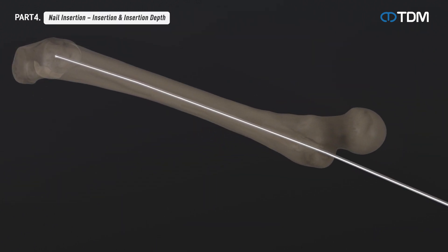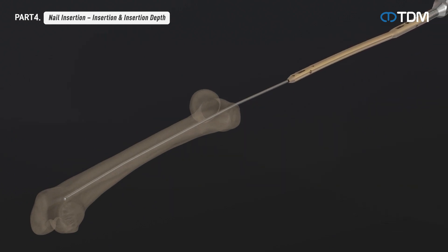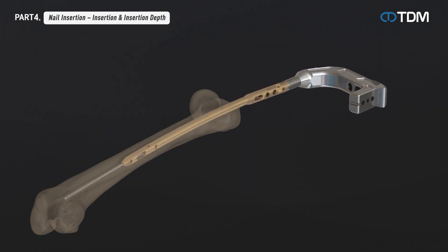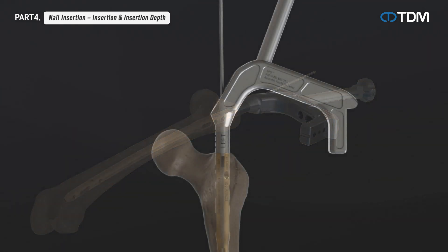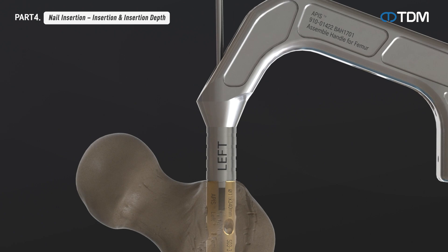When the nail and assembly handle are combined, insert the nail along the reaming rod. To prevent additional damage, the nail is inserted by turning it in the lateral direction while inserting it anteriorly, based on the assembly handle and according to the curve of the bone. Attach the impact handle to the assembly handle as necessary and use light, controlled hammer blows to seat the nail into the desired position. Check the nail end points with the barrel gauge of the assembly handle, marked 5 millimeters apart, when the insertion is complete.